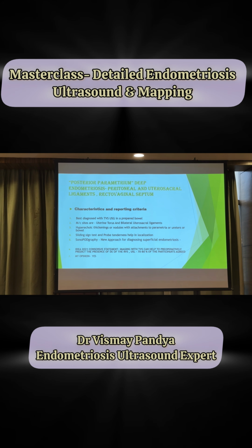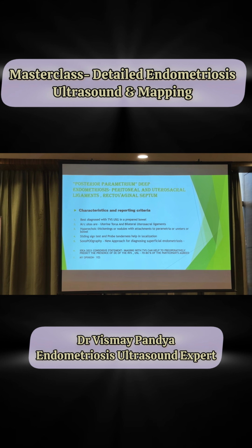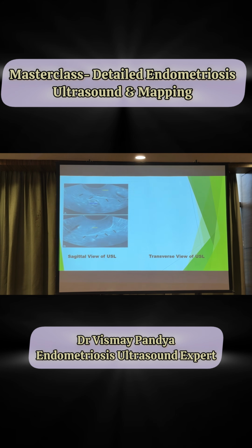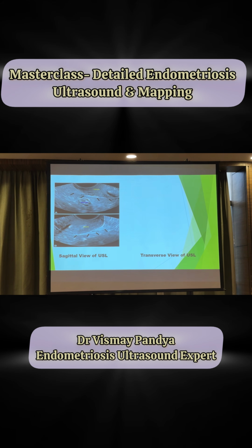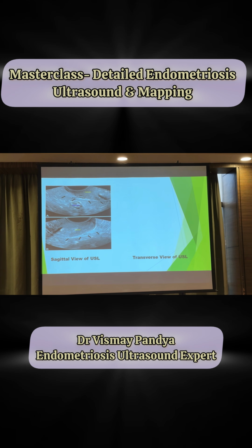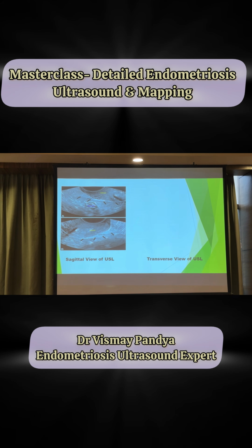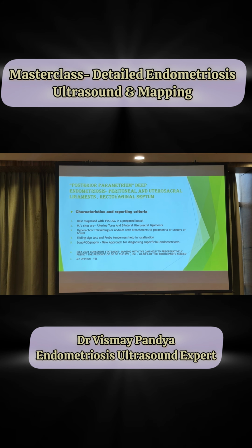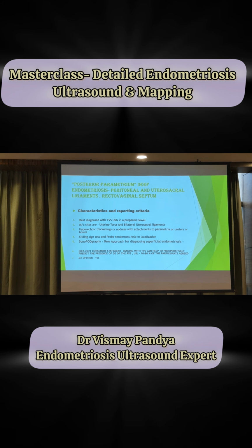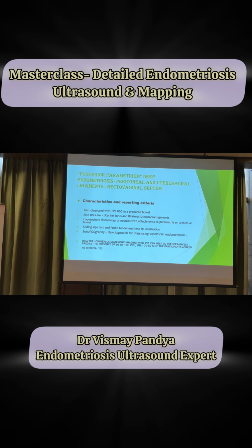Now there are two main findings of uterosacral endometriosis. One is that the uterosacral ligament can be seen like a white line in a sagittal section. It starts from the cervix, and if you put your probe in the posterior fornix at a 45-degree angle, you will see both uterosacral ligaments. In endometriosis, there is a thickening of this white line, and in general terms, the thickness is 4, 5 millimeters.